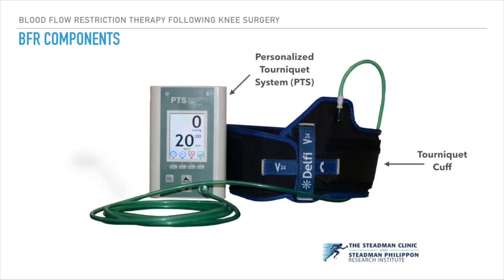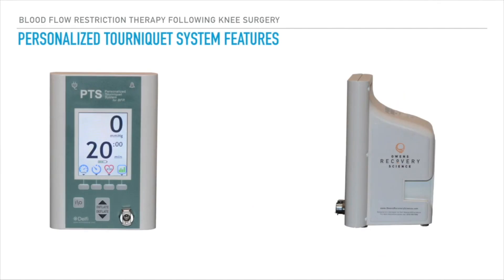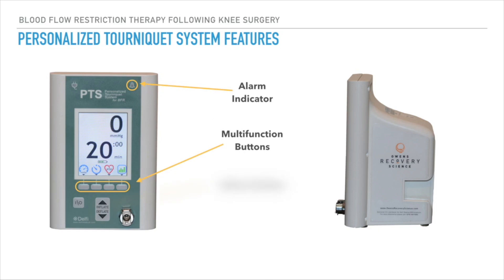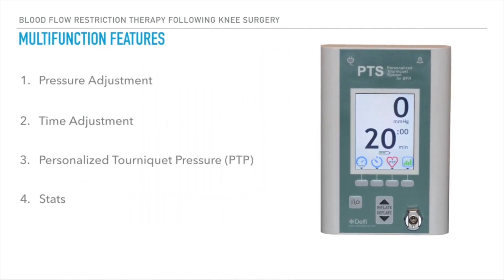BFR is run by a personalized tourniquet system, which is connected to a tourniquet cuff through a hose, ultimately applying a pressure value tailored specific to each patient. The multi-function buttons are used for setup and navigation through the LCD screen, and the inflation and deflation buttons are utilized for pressure application during low resistance exercise.